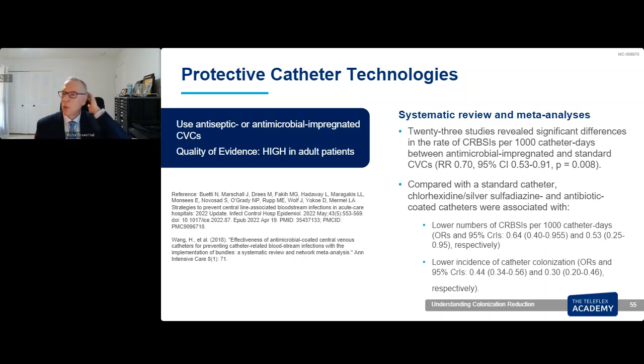What is an additional recommendation? It is when you have in your ICU a CLABSI rate above what is expected, above the standard, a high rate of CLABSI. Number 1. Number 2, a patient has previously had CLABSI. We are discussing protective catheter technologies. And for example, a patient with cancer, chemotherapy, neutropenia, extreme ages, neonatal patient, or a very old patient, burn unit, trauma unit. All of them are indications for this. And the one I like is when the CLABSI rate is above the standard.